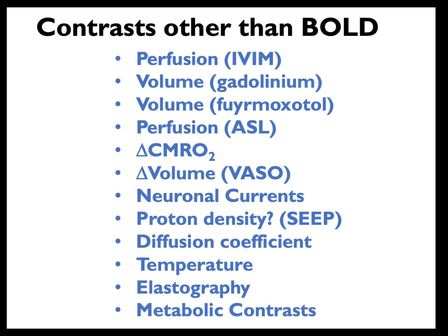Yeah, well, I think that baseline perfusion, I mean, as far as activation, bold is way better. But looking at, for instance, baseline perfusion, I think it has potential. It seems that the amount of perfusion in the brain is almost directly proportional to the amount of baseline metabolic activity, and so you could compare perfusion maps across populations, like people with ADHD or people with schizophrenia, to actually get baseline comparisons of what parts of the brain are more active overall. So I think that has a potential application.